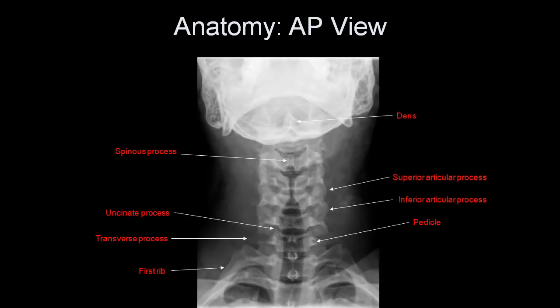On the AP view, you can see the dens projecting over the mandible, the spinous processes, the uncinate processes of the vertebral bodies, the transverse processes, the superior and inferior articular processes, the pedicles, which are round, and the medial aspects of the first few ribs. When counting vertebral bodies, the first fully formed vertebral body you see is C2, not C1.